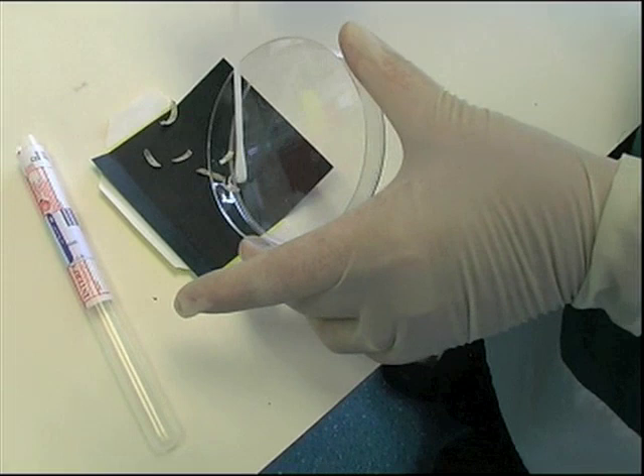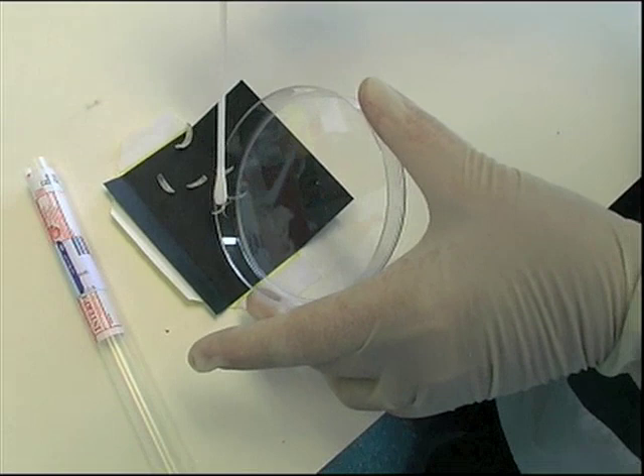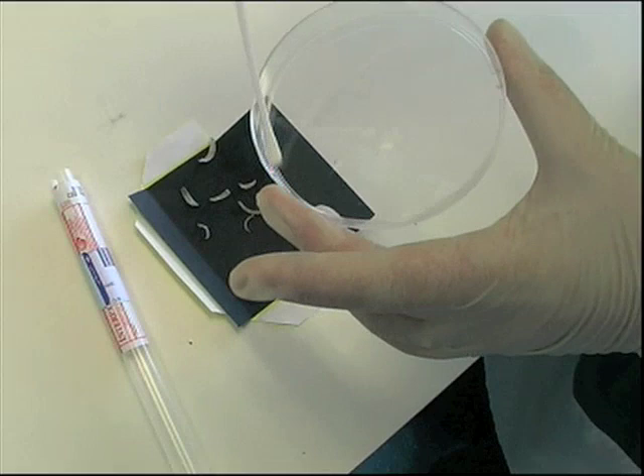This is often a difficult process due to the electrostatic charge associated with plastic containers. Use a swab to help sweep the specimen onto the card and to pick up any small bits. When finished, also send the swab to the laboratory.